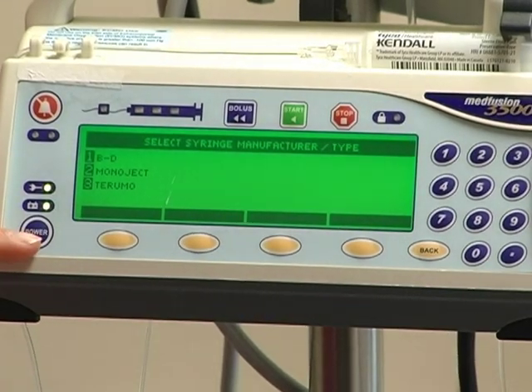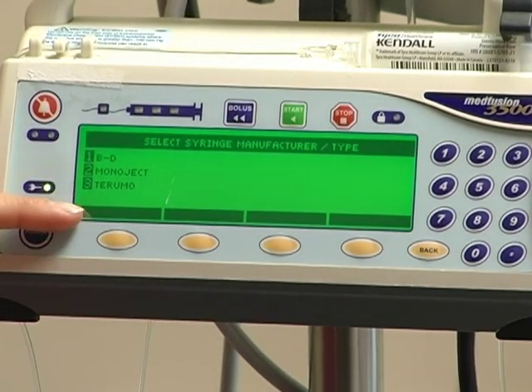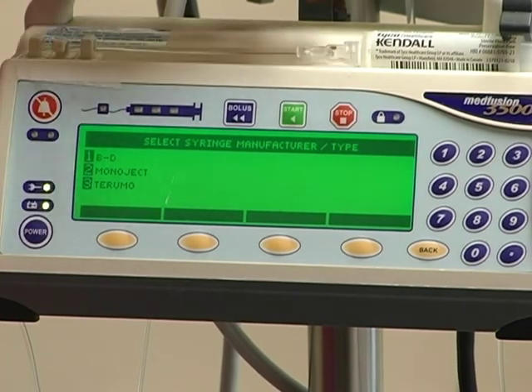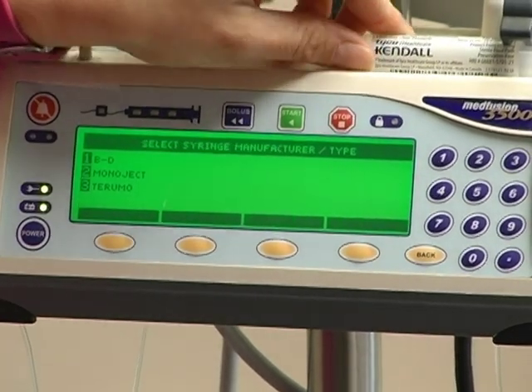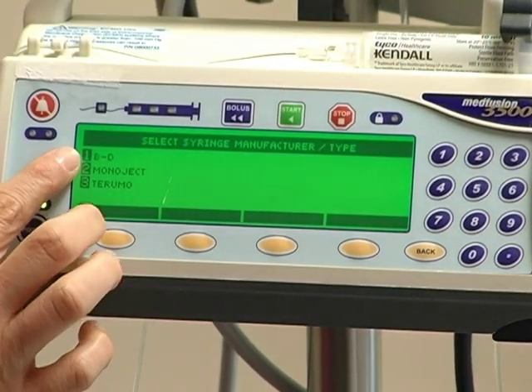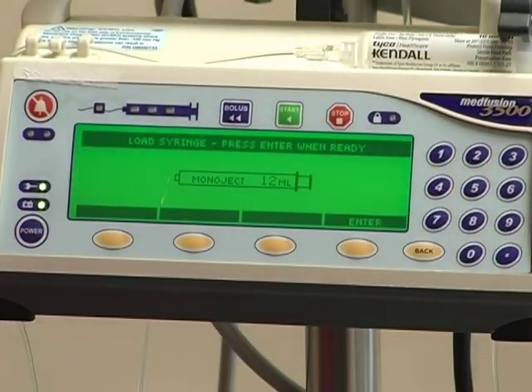The next screen will ask you what brand of syringe you are using. On Pediatrics we use the Monoject syringes, and that is visible on the actual syringe. So you again just press the number that corresponds, which is 2.